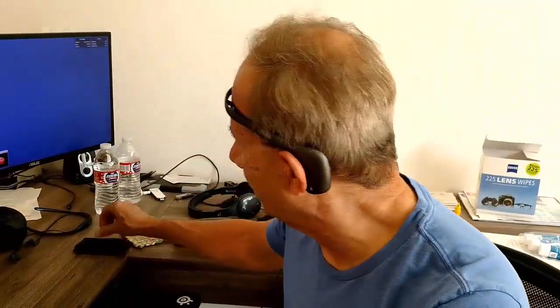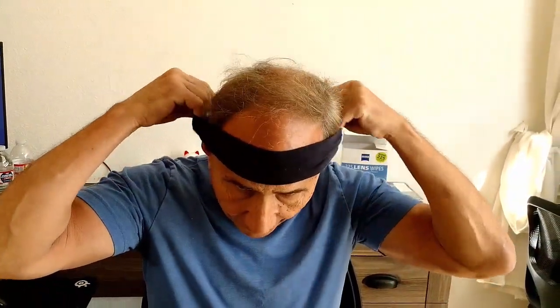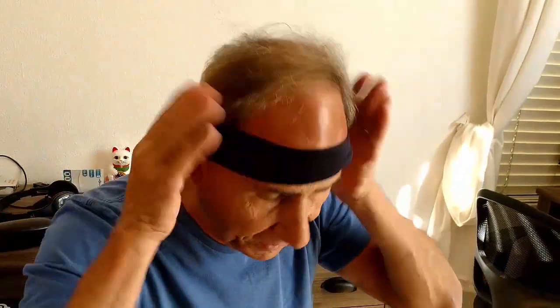So what I do, since I've been experimenting with things, is I borrowed one of my wife's headbands, and I use the headband to secure it even better. Now, you see here that it's secured, and in fact, it's even better if you put it back like that and make sure that it's good and tight.